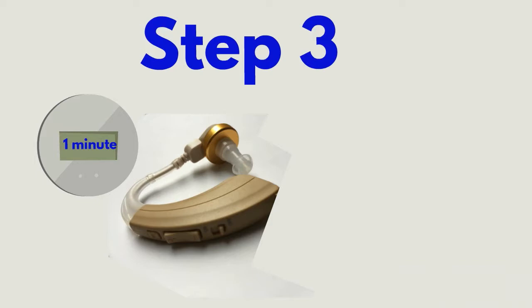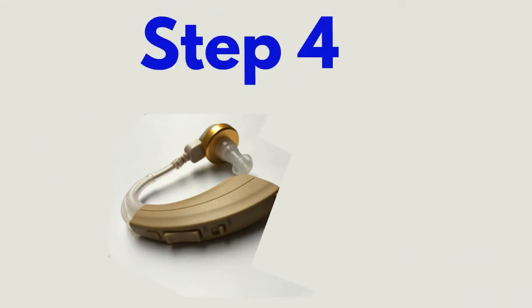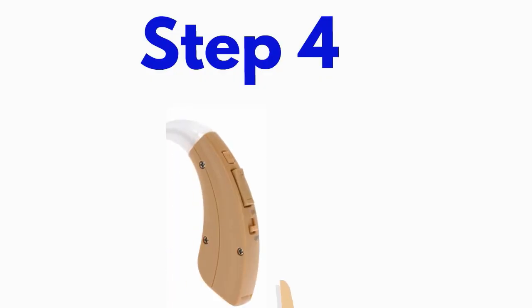Then gently close the battery compartment securely. Step 4: Turn on your amplifier using the on switch.